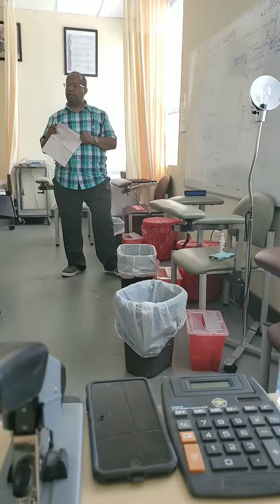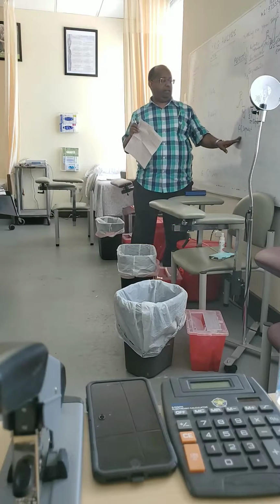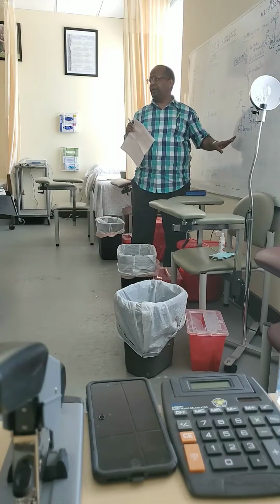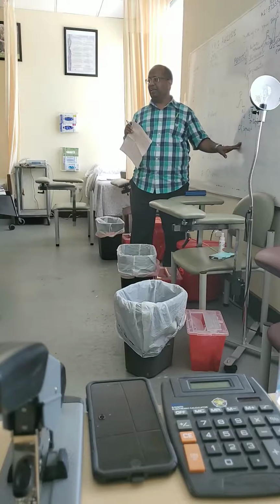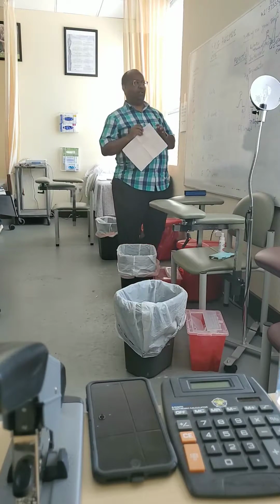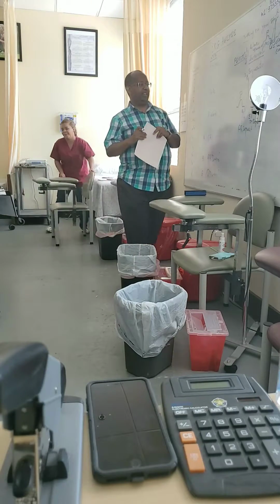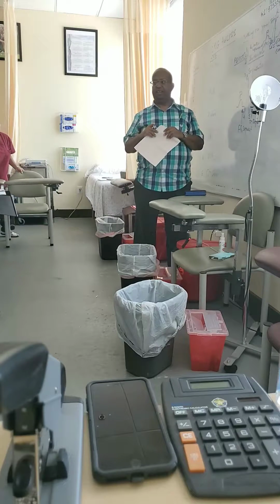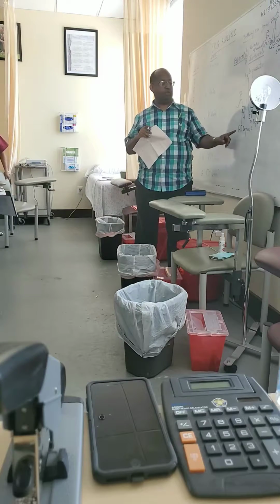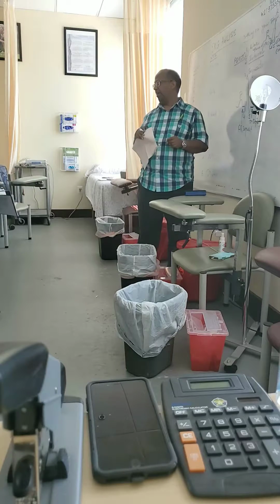Because we are Americans, we say PR interval, PR segment. If you go to Britain, it's called PQ. That makes sense, to call it PQ. It was closer than the PR. So PR is American, and Q, the Queen, PQ.